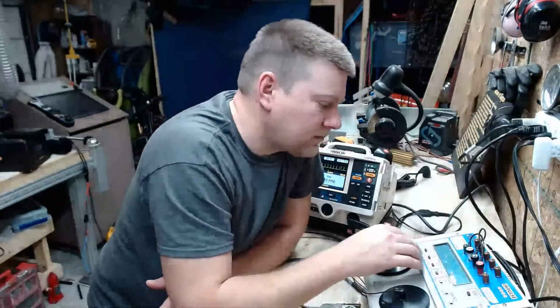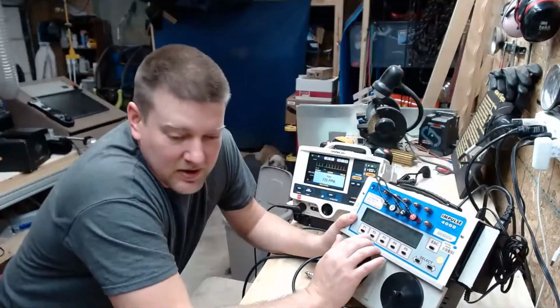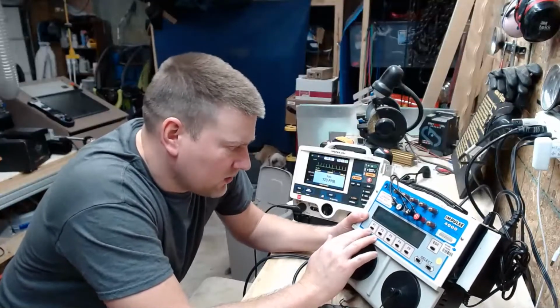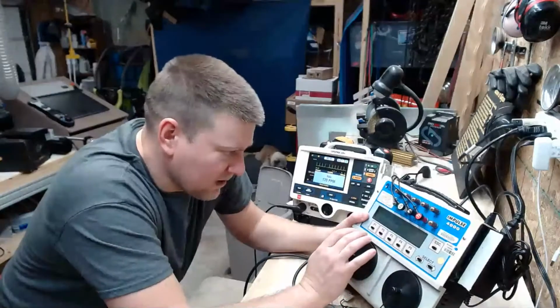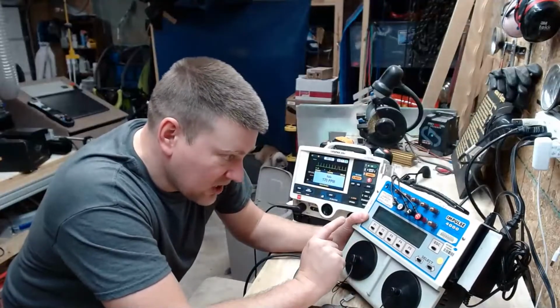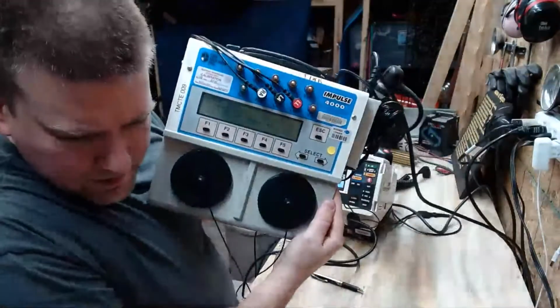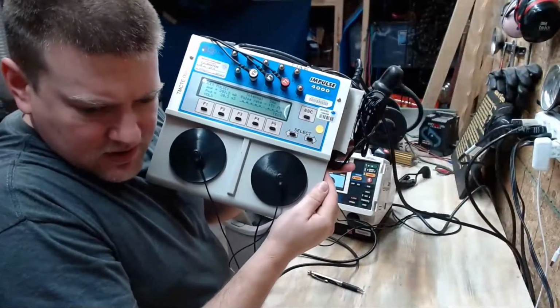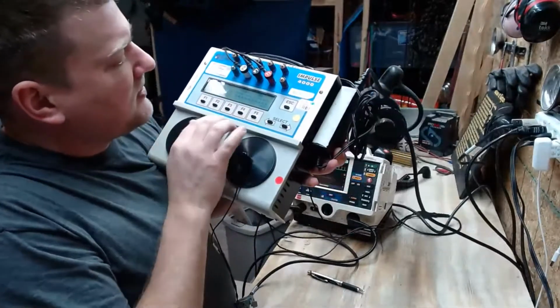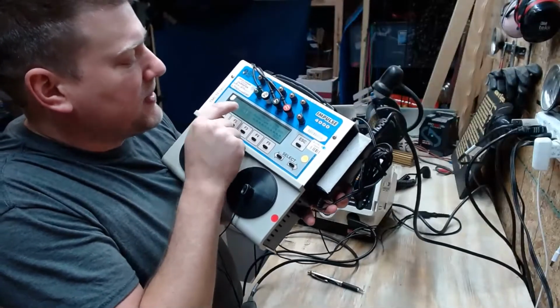Okay. And on the analyzer, the second next to defib is pacer. So we go into pacing function. We are going to use internal 50 ohm resistive load, and we're going to check for pulses. So the little analyzer, let's see if I can pull this into frame. So you can see the pulses that it's detecting, and it does a graphical representation right here. At the same time, it shows you how many ppm you have, along with how many milliamps.